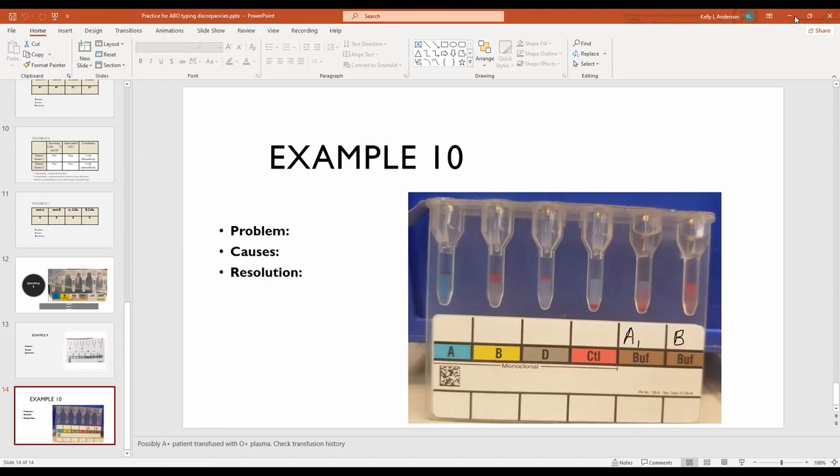You look so confused. I have to read about it, because isn't it something to do with the LISS and the zeta potential, the bunch of negative charges around that cell? That's different, because in the ABO you're not using anything like that. That is the function of LISS, low ionic saline. But in Rouleaux, it's just the plasma that you're removing for the saline replacement, because it's not actually bound.